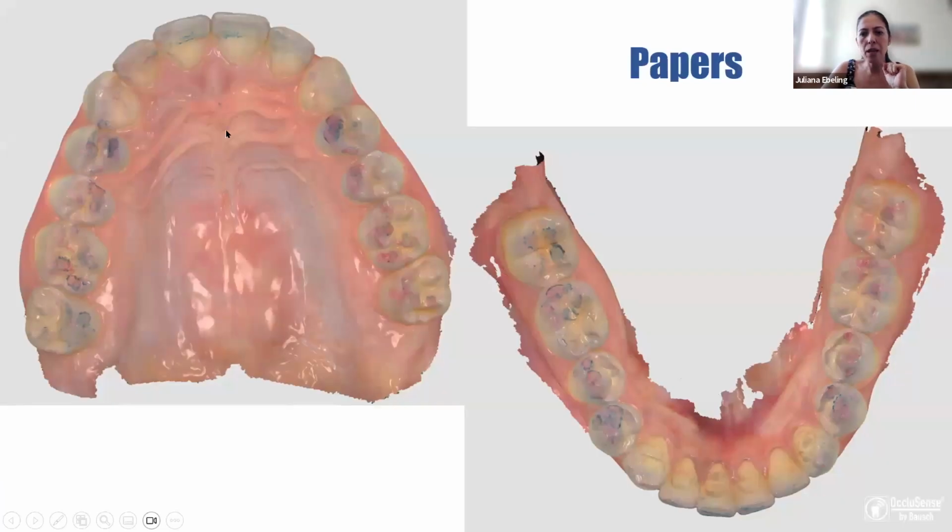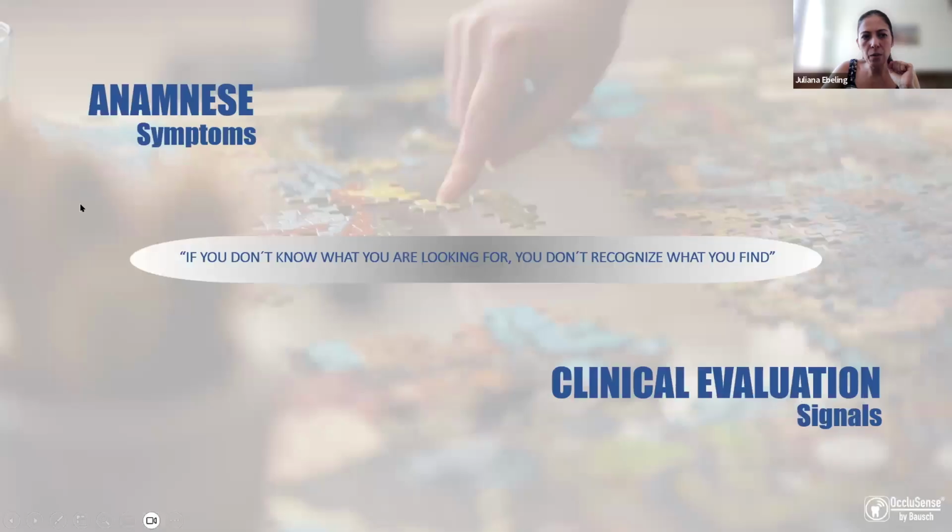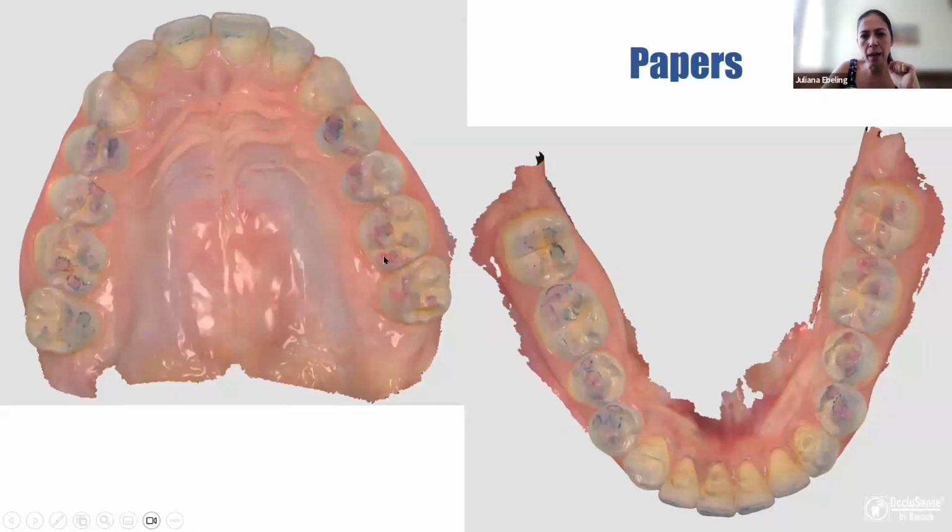And how can we see this here? Look, I have the blue one here, and when I use the thinner paper, I have the surface. Here I really have no spot contact pattern. I have larger contacts. This is what the combination of the papers is showing us.